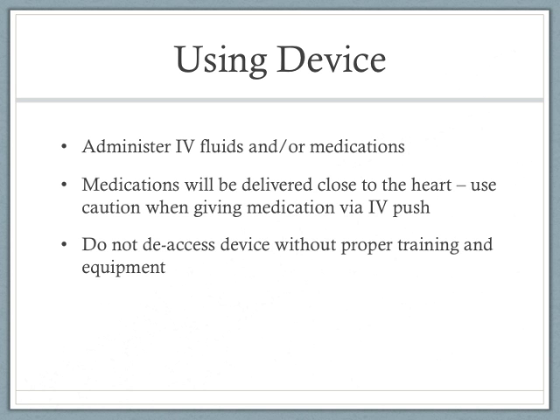You can administer IV fluids and medications through it as you would through a peripheral IV. One consideration to be aware of is that this medication will be delivered pretty close to the heart. You should be cautious when giving things by IV push to make sure that you don't push them too rapidly. You should also make sure that you do not de-access the device without the proper training or equipment.